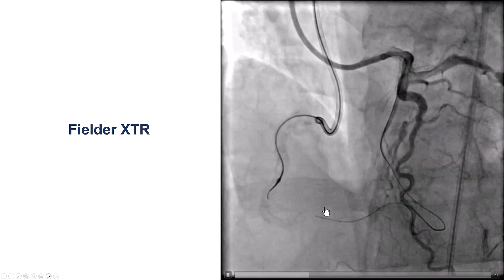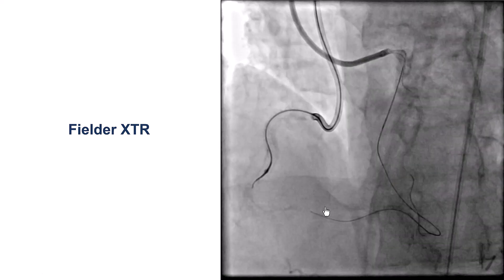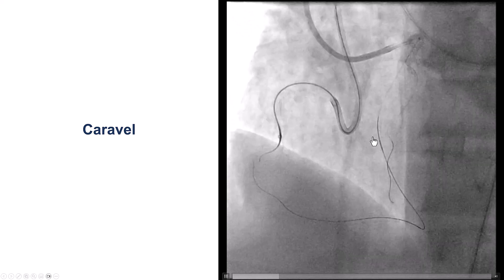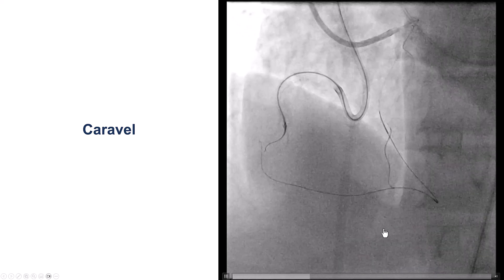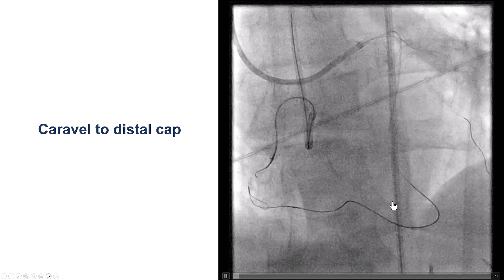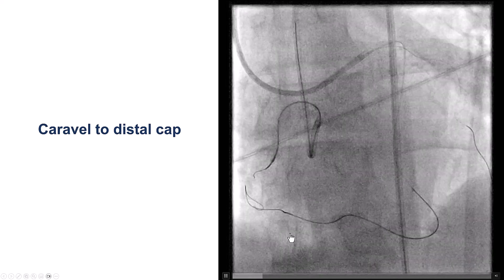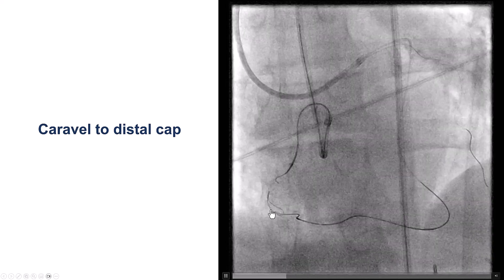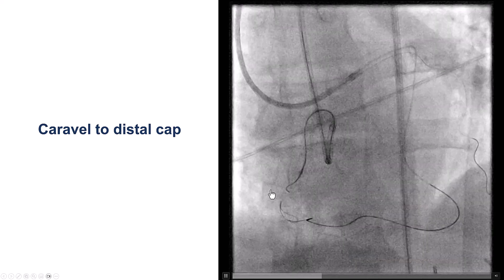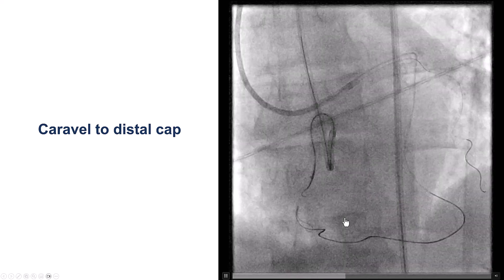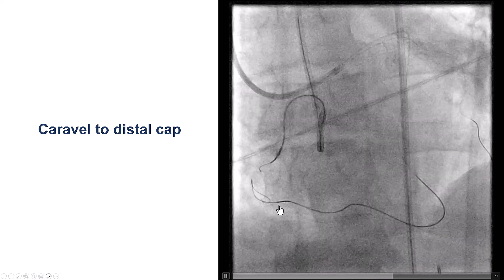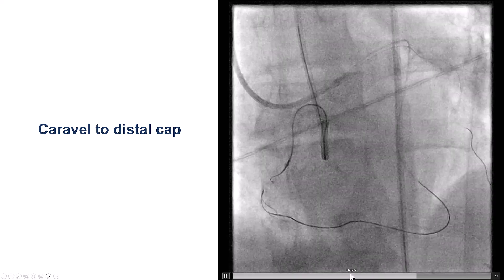This was confirmed with injection from the left. We then tried to deliver the Caravelle microcatheter down into the posterior descending artery, and eventually were able to get it all the way to the distal cap. It was indeed a fairly short CTO, but there is significant tortuosity both distally and in the more proximal portion of the right coronary artery.